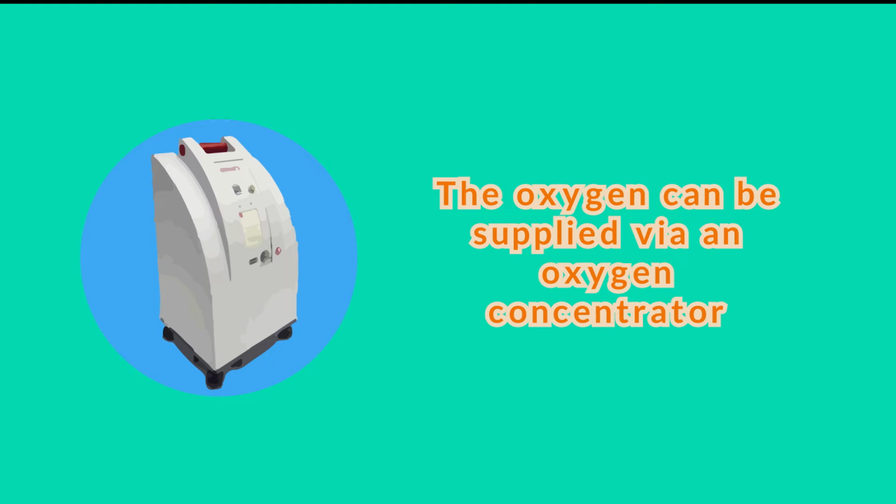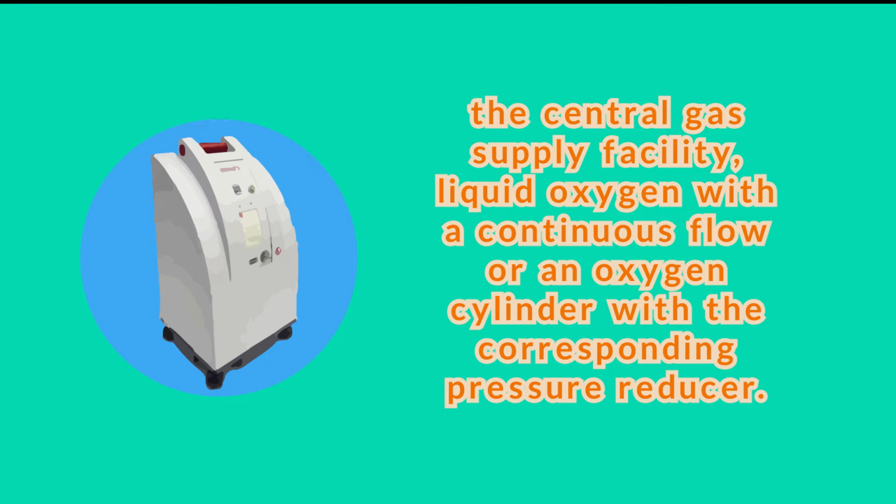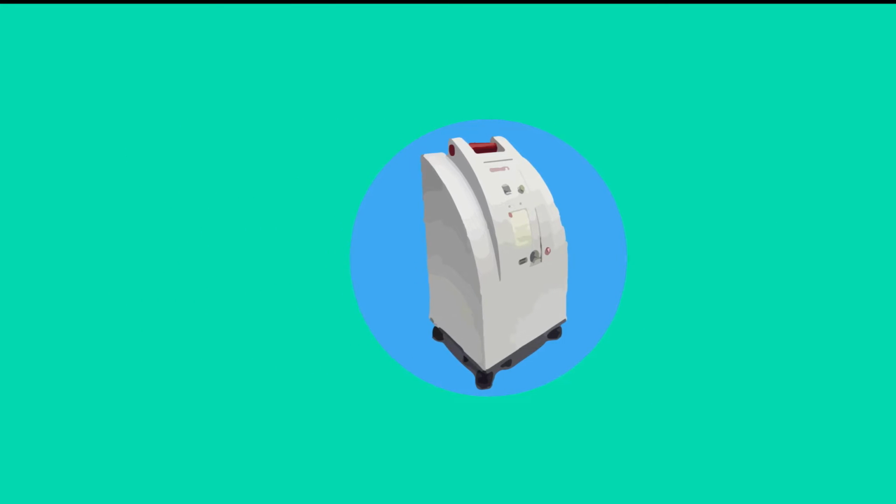The oxygen can be supplied via an oxygen concentrator, e.g. Oxymat 3, the central gas supply facility, liquid oxygen with a continuous flow, or an oxygen cylinder with a corresponding pressure reducer. The external oxygen source must have a flow adjustment device independent of the VentiO2.